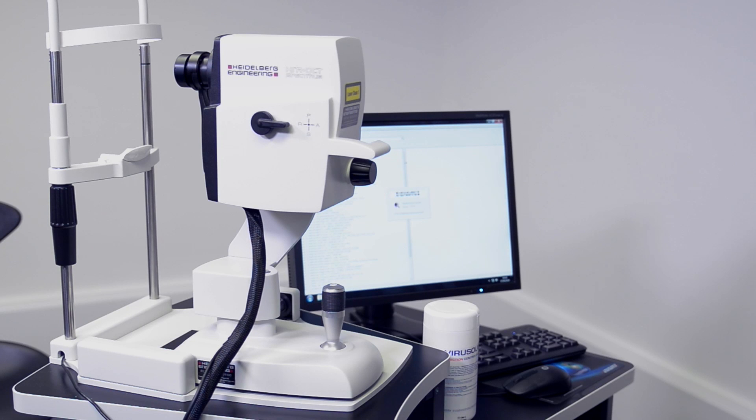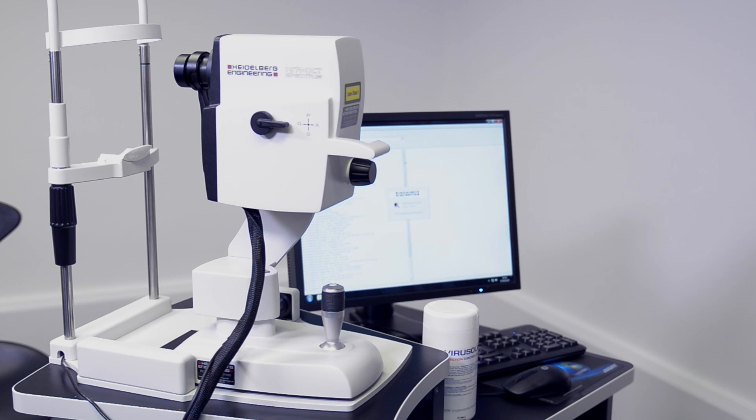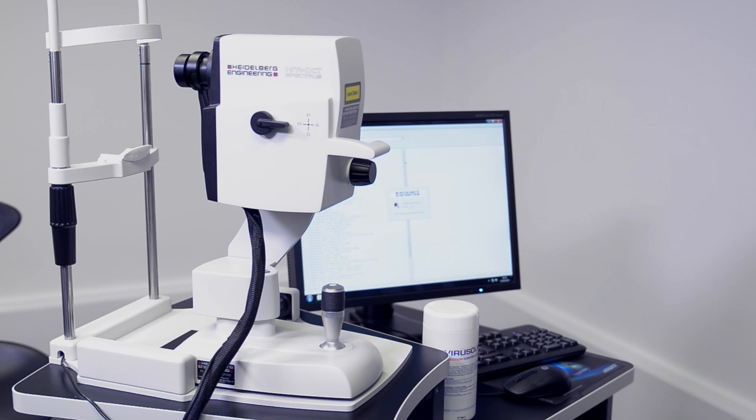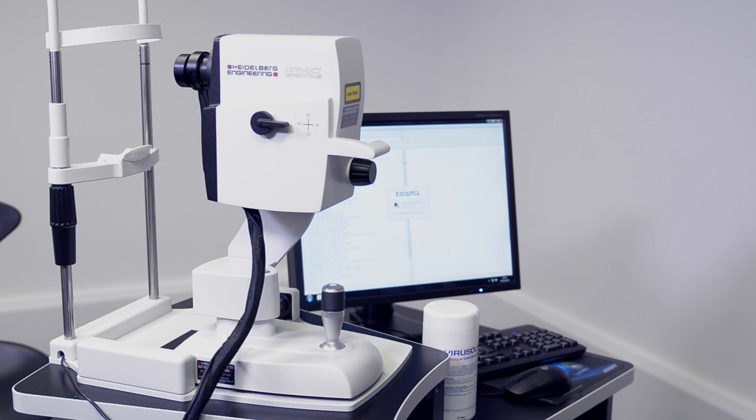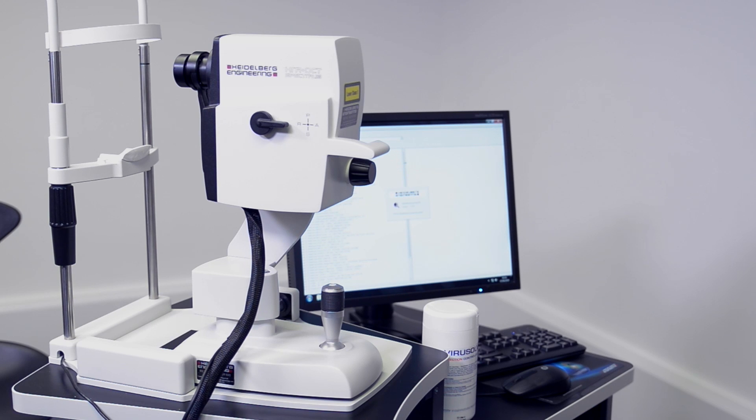The following video uses a clinical case study to demonstrate how OCT can be applied in the case of acute vision loss.